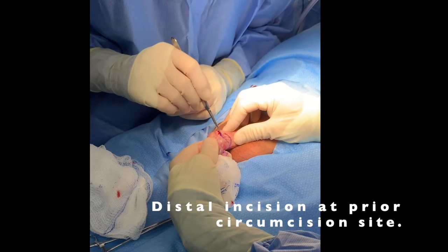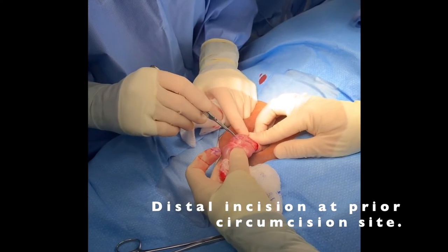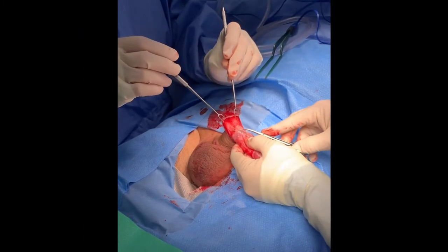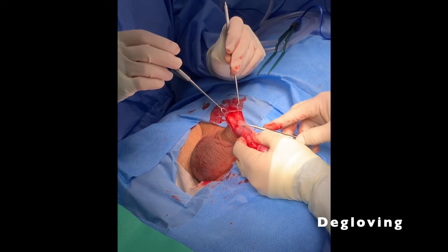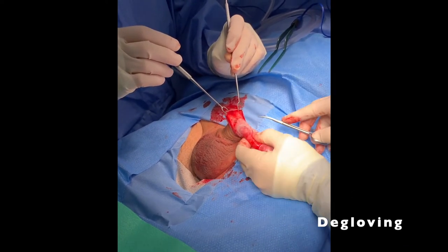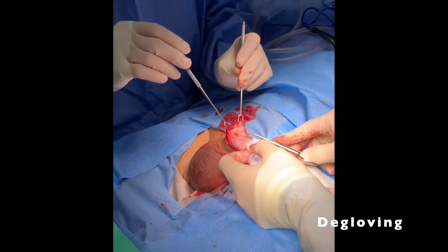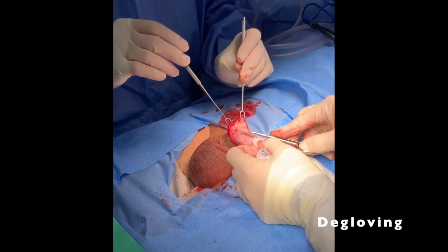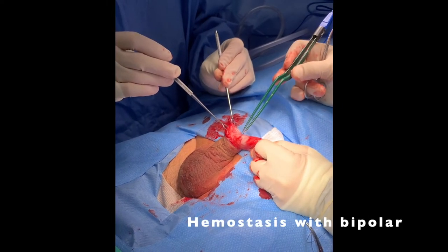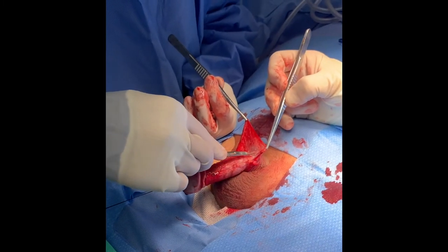A circumcising incision was made down to Buck's fascia. The penis was degloved. Tissue handling techniques are crucial, obtained by using magnification loops and proper instruments. Attention is directed to develop the proper plane between Dartos and Buck's fascia. Hemostasis was obtained with bipolar electrocautery. Degloving continued proximally down to the base of the penis.